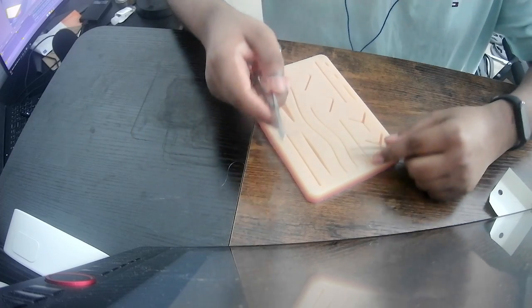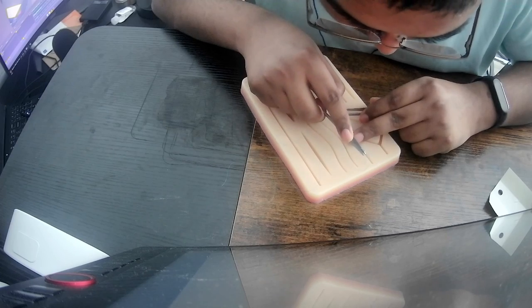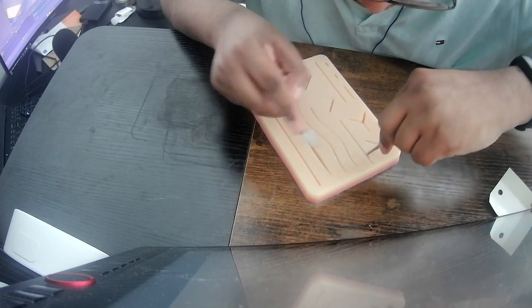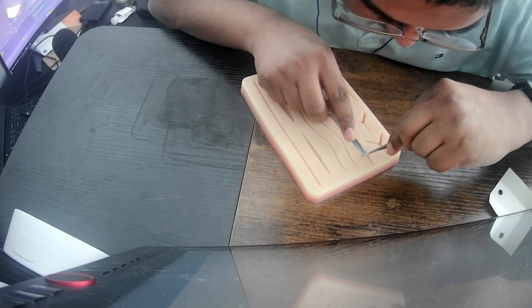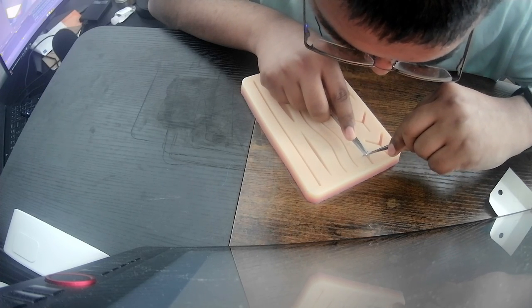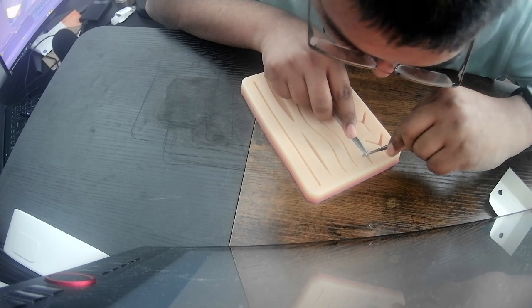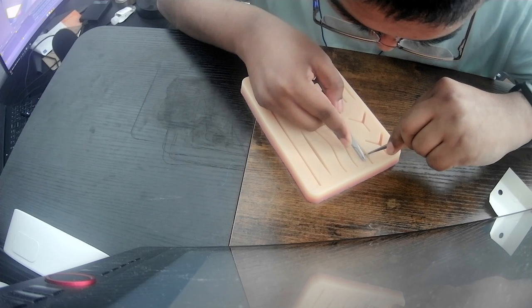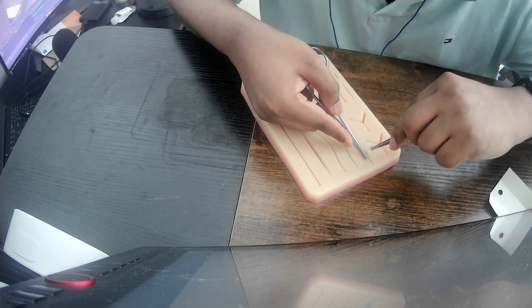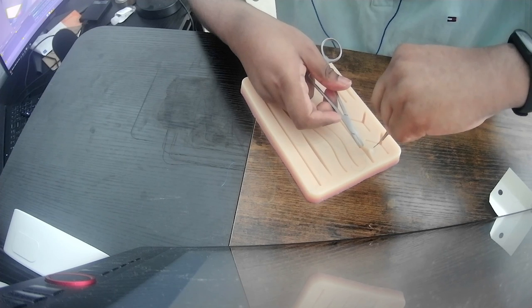Okay. Oh no. Okay, this is kind of scary. Okay, let's open up the skin a bit. Okay, I want to do it parallel this time, hopefully. And I gotta take a guess at the depth. No, that's too shallow. Come on, where is it? Maybe here? Oh no, shit. Is that enough? I think that's too close to the edge. So let's find out though. Can we drive it? Very good.